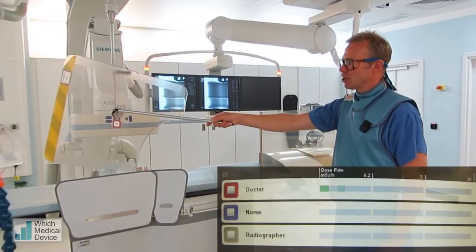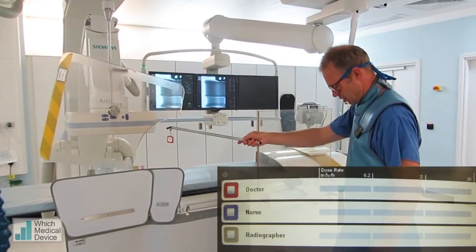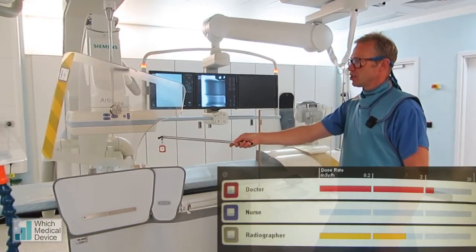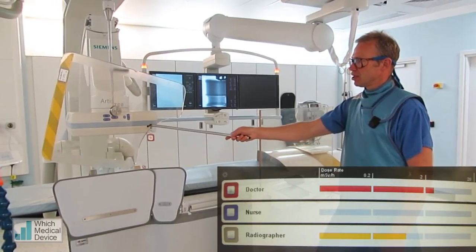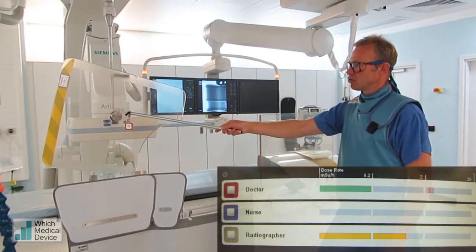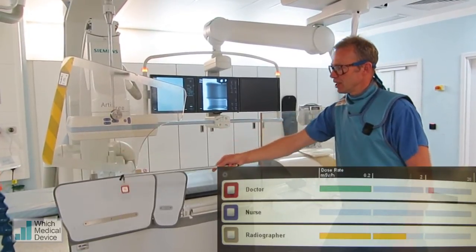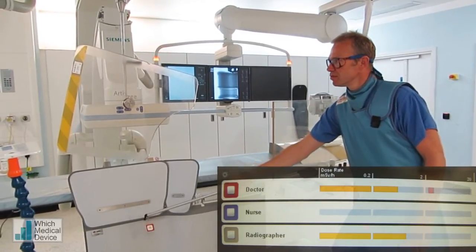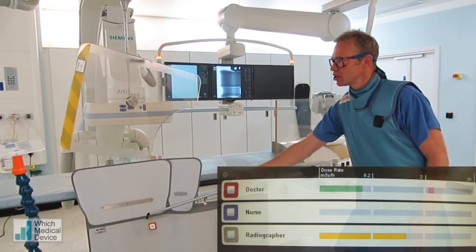If we just do a digital subtracted run again, let's just look at the difference that makes. Here we're certainly up into the red, and behind the screen it's gone right down into the green, and behind this screen it's dropped right down into the green again.